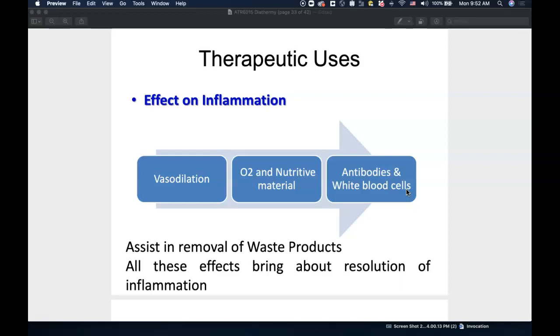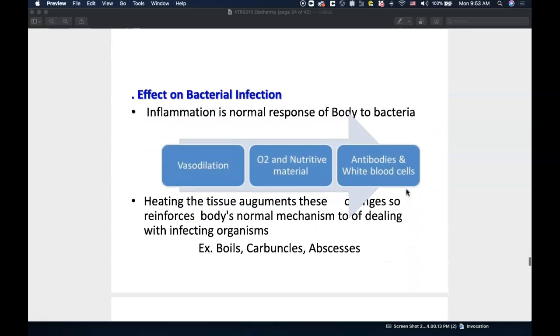So using diathermy to me is really advantageous to not only just reducing inflammation, improving muscle efficiency and causing muscle relaxation, but certainly when we're really thinking about this overall, it seems to be extremely beneficial to the healing process when we're thinking of our patients.